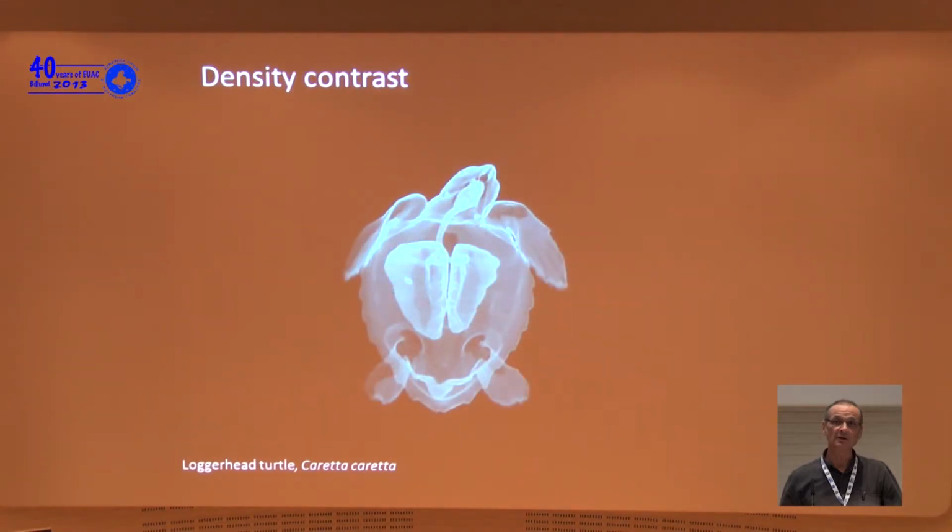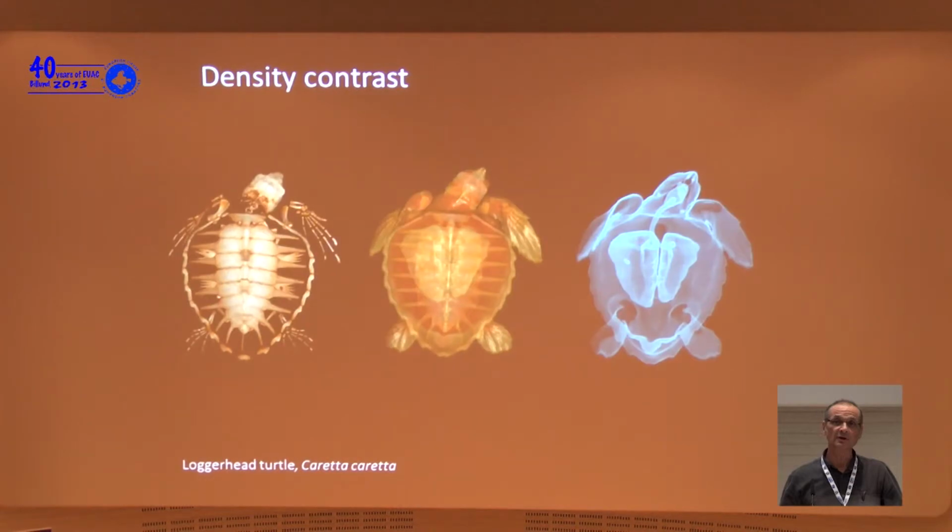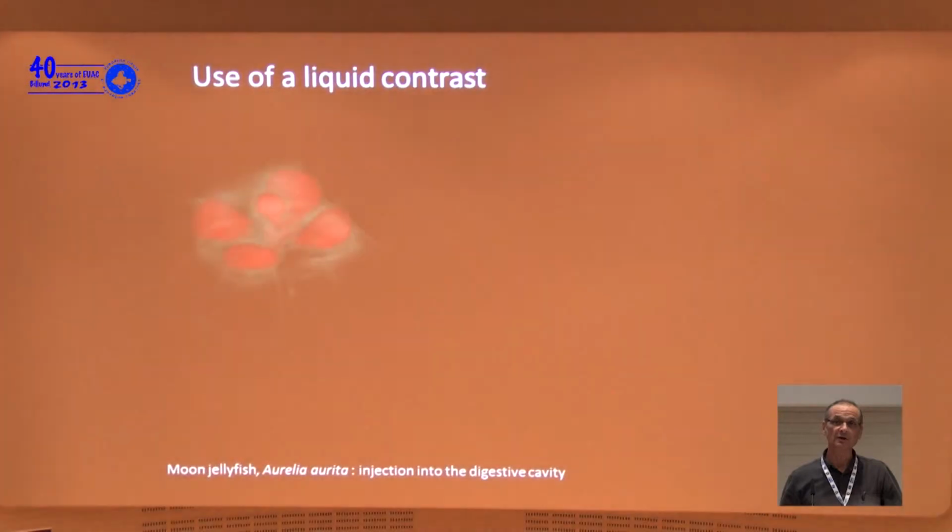And we can see the air part and the lungs. I had marked the lungs. So we can do a lot of images.